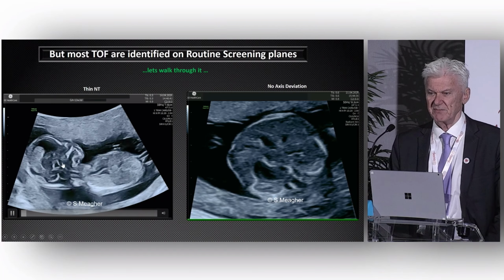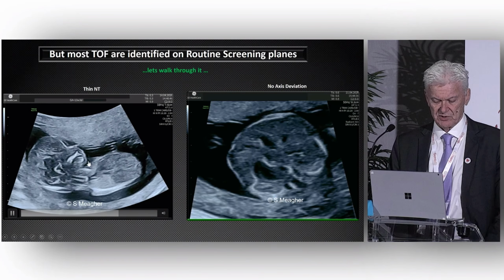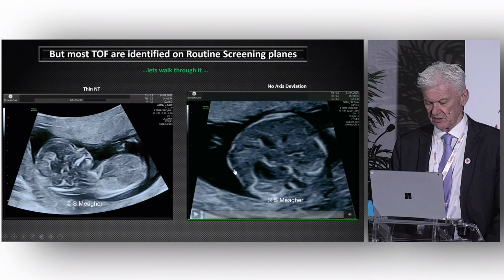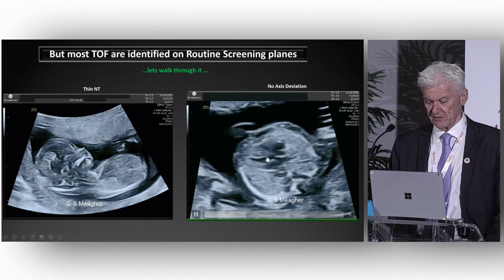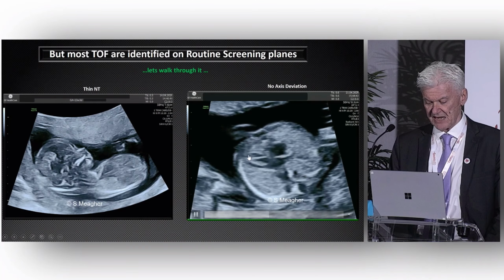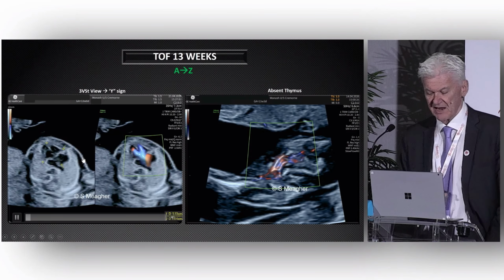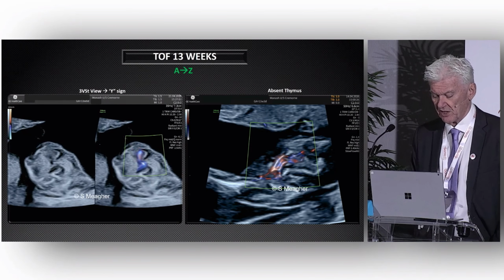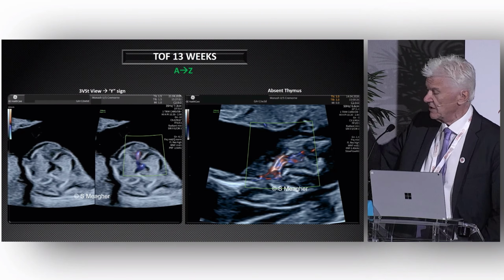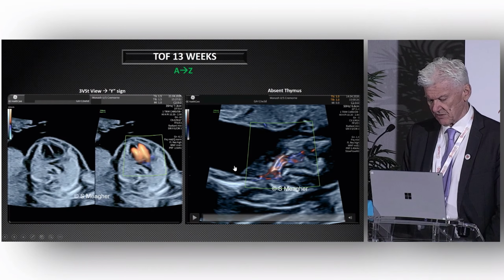You go to work tomorrow morning, none of these signs are there. You start off and you tell me what's going on here. You scan a baby who's got a thin nuchal translucency, a normal cerebral fourth ventricle, normal nasal bone. When you look at the stomach, you look up to the 4-chamber, there's no axis deviation. Next step is you move to looking with your color. And this is why the sonographers pick it. Because when they sweep from a 4-chamber up to the 3-vessel tracheal view, they see the Y sign. There's actually very little discordance between these great vessels.